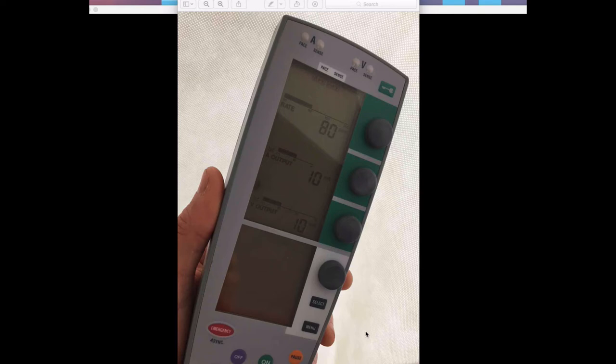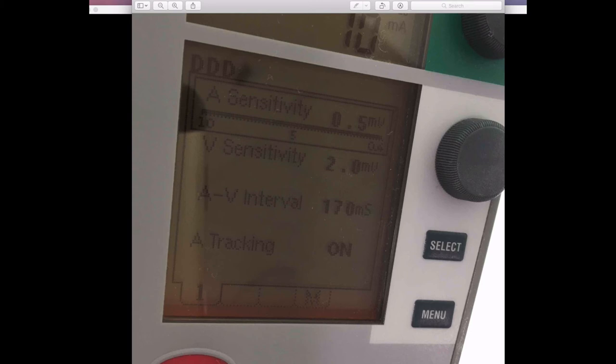The control interface has an upper panel and a lower panel. The upper panel lets you control heart rate using a dial, atrial output, and ventricular output — defaults are 80, 10, and 10 milliamps respectively. The lower panel is activated by pushing the selector menu buttons; using the buttons and dial together, you can scroll through options including atrial sensitivity, ventricular sensitivity, and the PR or AV interval. In a different menu, you can control the mode: DDD, DOO, or the atrial and ventricular analogs of those two.